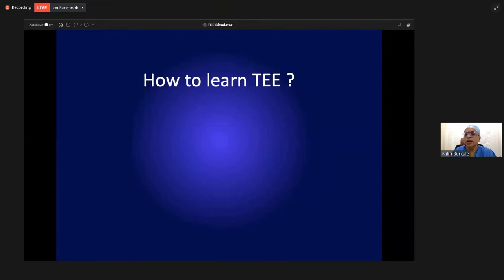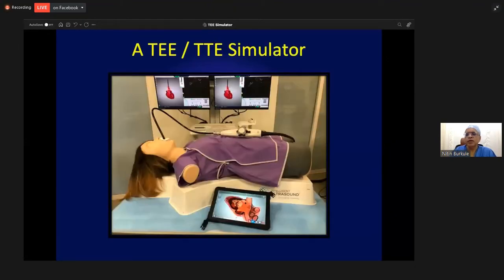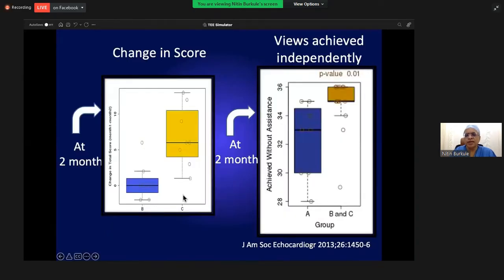But how to learn the transesophageal echo? The best way to learn the transesophageal echo is on simulators. Now, the simulators have gone to a very high level, and this is one of the simulators. The simulation is now real lifelike, and it gives you a lot of time to learn each of these views. And there is a study to show that those cardiology fellows who are trained conventionally versus those who are trained on a simulator, at the end of 2 months the simulator group are much more proficient to take most of the transesophageal views.